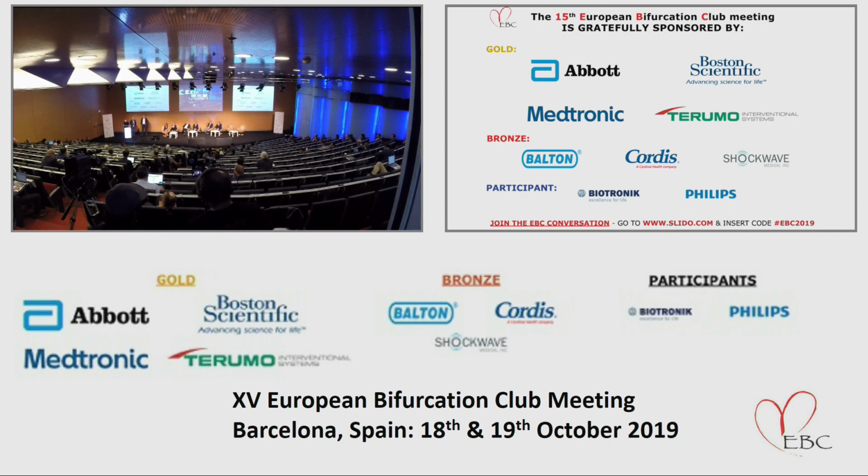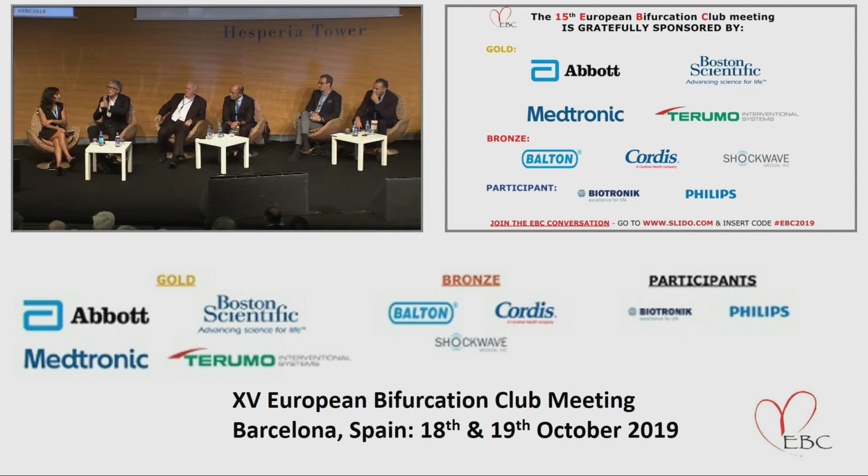Yeah, Tom, the question is not between different techniques. We are talking about crush. If you do a crush, it should be a DK crush, yes or no. So we are not talking about other techniques. And the question is just because the DK crush technique improves the rate of final kissing balloon inflation. It's 100% if you follow all the rules, versus 80% if you do a classical crush technique.